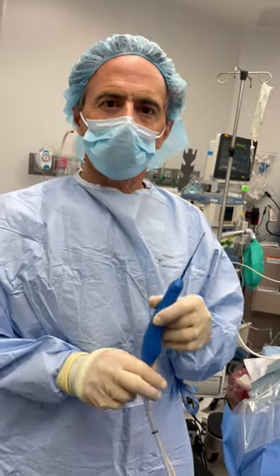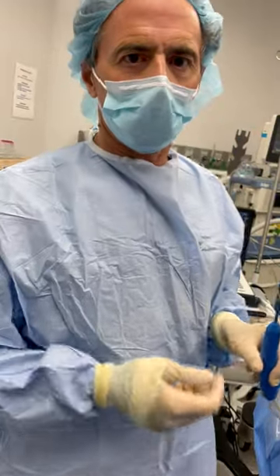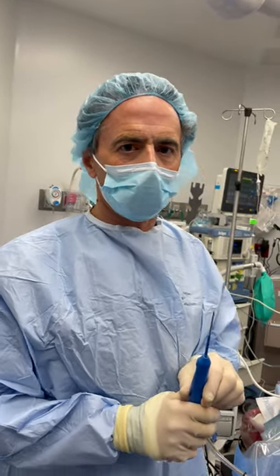This is a wonderful minimally invasive treatment that we've used to debris tissue. It can be used for tendons, ligaments, joints, knees, elbows, shoulders, ankles — all that sort of thing.